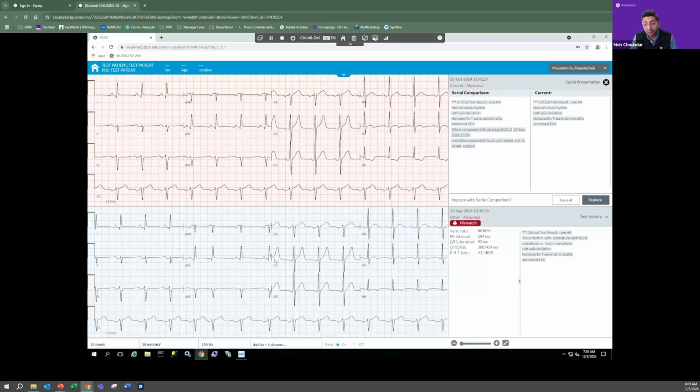That would require the thick client version. It would not be possible on web, but that's also along the lines of what I said in the past: it is something we've heard and are working on to address as well. On this one, also, we're not in a place where I can provide any timeline or specifics on the release, but that's something we know our customers are interested in seeing.